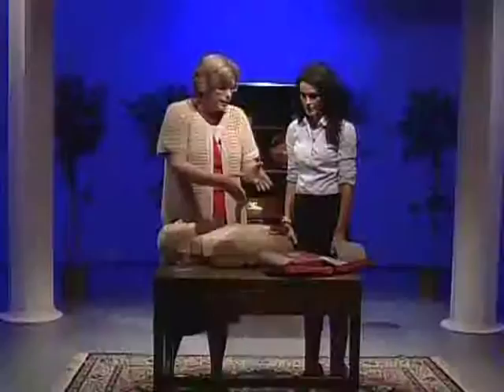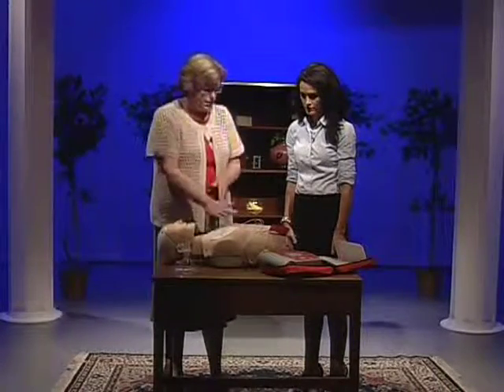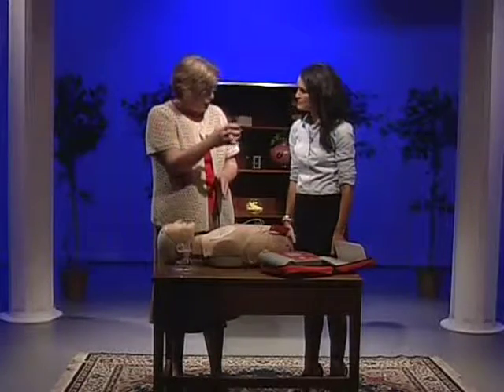The electrical shock from this is going to just stop that quivering and give the heart an opportunity to develop an organized rhythm again. Okay? So that's what this machine is doing for us. If you're in ventricular fibrillation, it's going to stop that quivering and give the heart an opportunity to develop a normal beat. There are other rhythms that people can have.